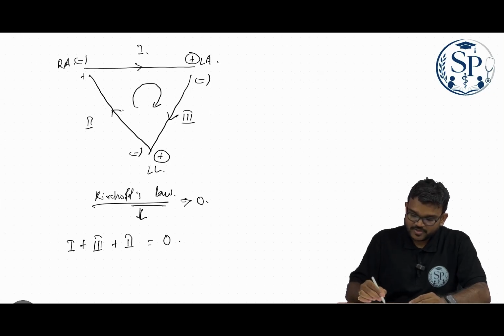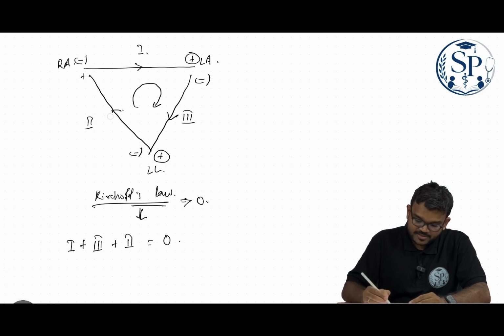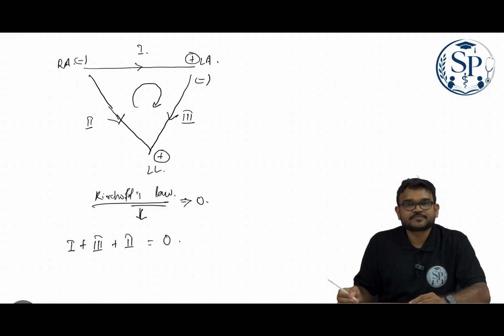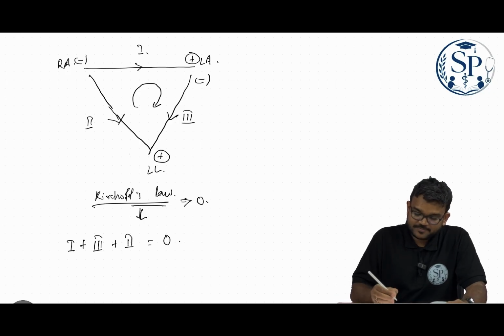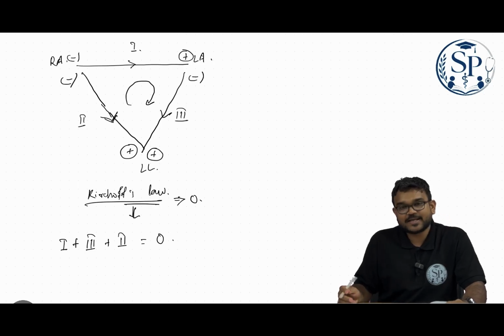Later on, he reversed the direction of lead 2, so the direction of the current is reversed. What will happen? The negative end will be on the right arm and the positive end on the left leg.